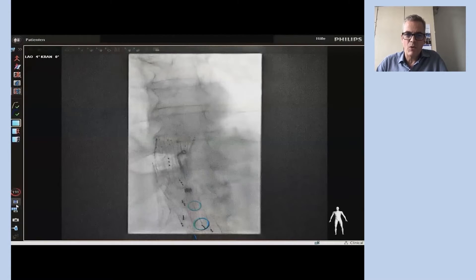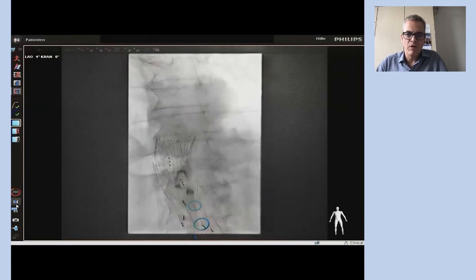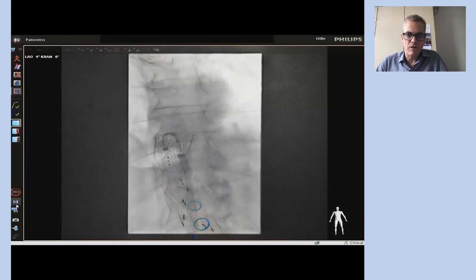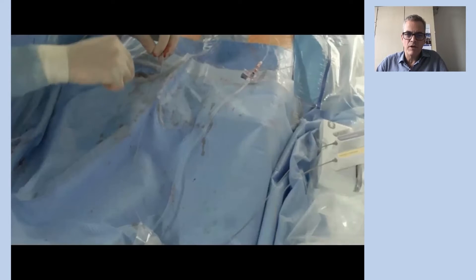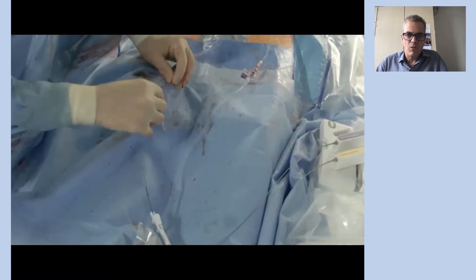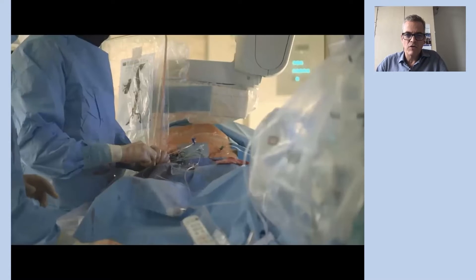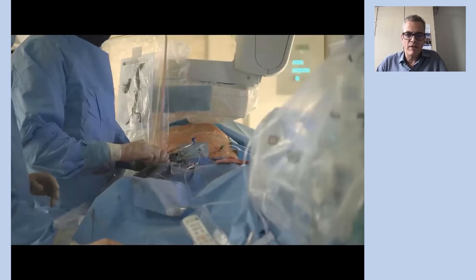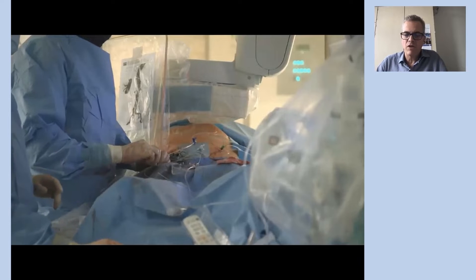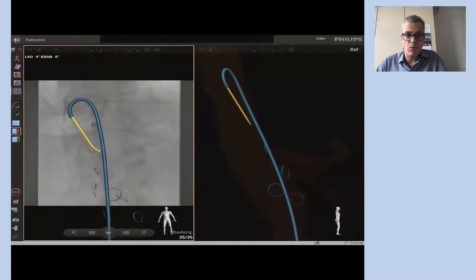Then we introduce a steerable sheath that is stabilized by a through-and-through wire, which you see here fixated with the clamps. That's our way of securing stable access when using transfemoral access in branch repair. The FORCE wire and catheter tolerate this very significant bend of the steerable sheath quite well.